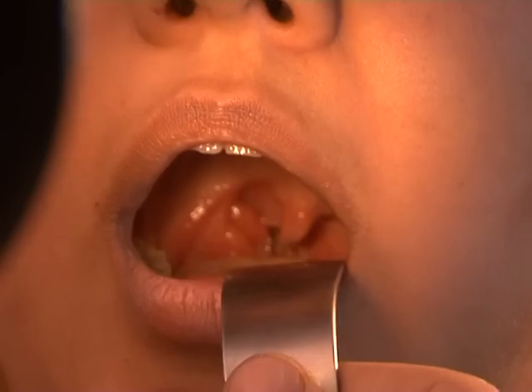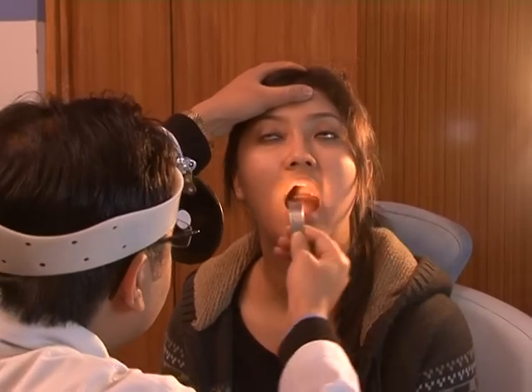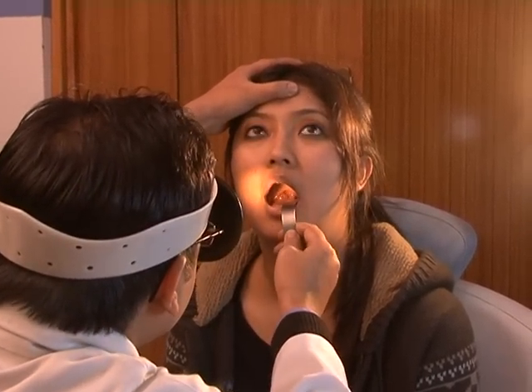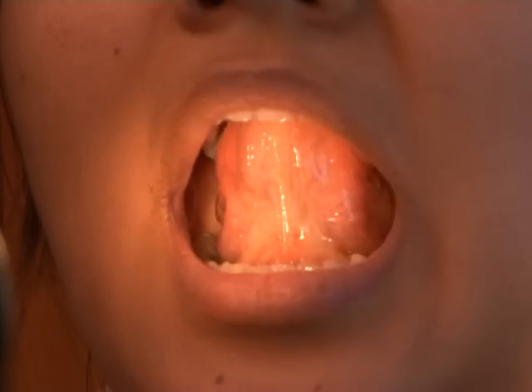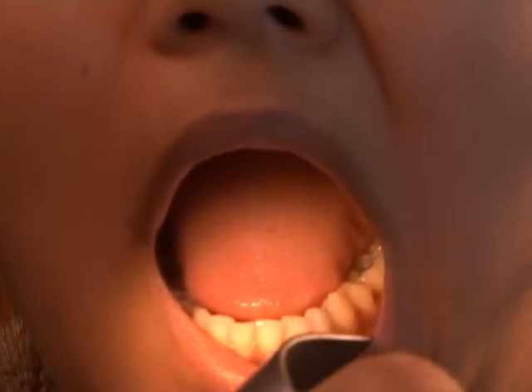The throat consists of the oral cavity and the oropharynx. In the oral cavity we examine: lips, teeth, gums, vestibule, parotid duct opening, tongue, hard and soft palates, floor of the mouth with submandibular duct opening, retromolar trigon, and cheeks.